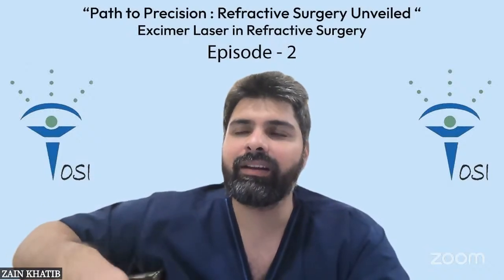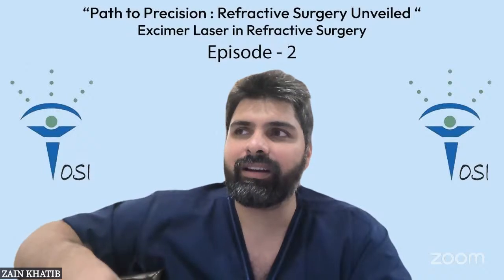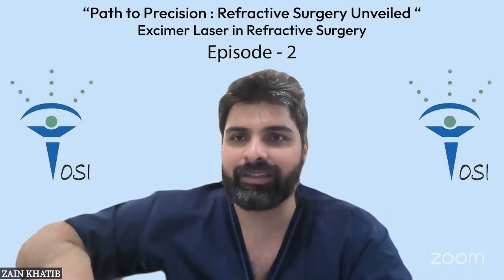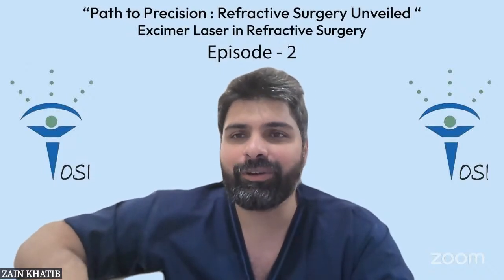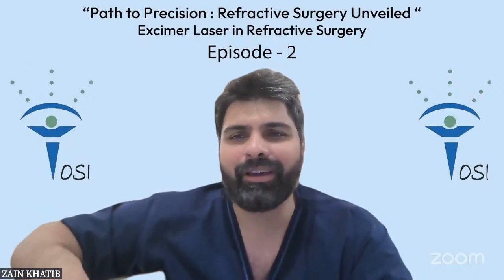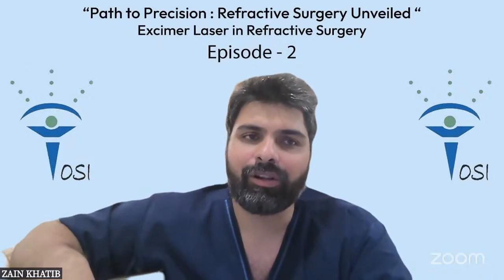I just 2 days back did a patient who was sent by another doctor saying that if you do any kind of LASIK, you won't be able to see your toothbrush or toothpaste, and she was very scared. I said, that won't be the case. You will be able to see. Do a good refraction, do a good monovision tolerance test, and she's happy. So you can actually build your practice on presbyopic LASIK also.